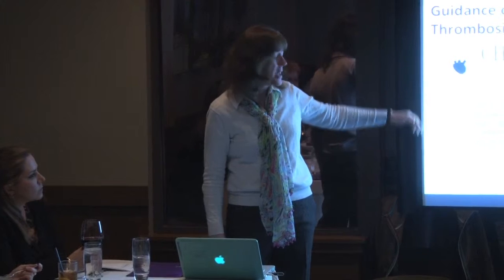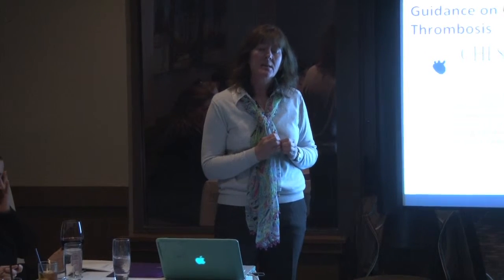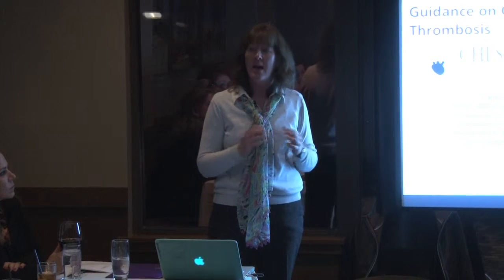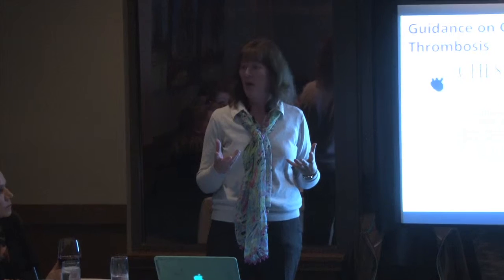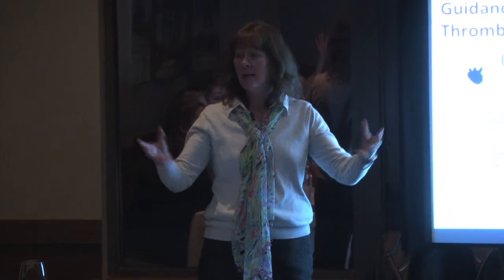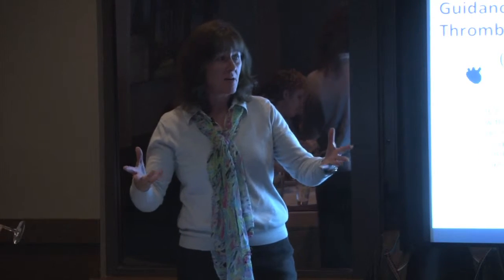Yeah. And I am actually, honestly, guys, in my travels across the states, seeing more places where they will leave the line in and treat if the line is still needed and it's functional. Yeah. And it all comes from you guys, the vascular access specialists, getting that dialogue going.